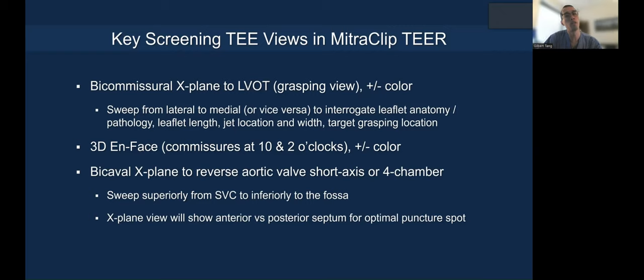What are the key screening TEE views for MitraClip TEER? I would say first, you start with bicommissural X-plane to the LVOT — the grasping view, with or without color — and do a sweep from lateral to medial, or vice versa, to interrogate the leaflet anatomy and pathology, leaflet length, jet location and width, and target grasping location.